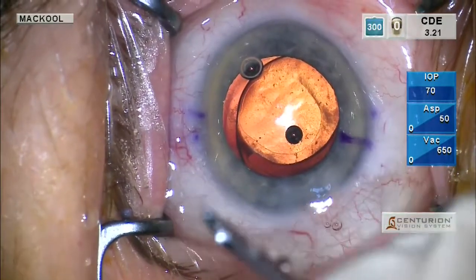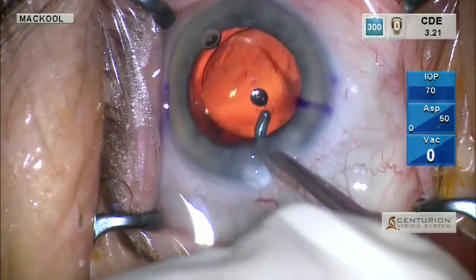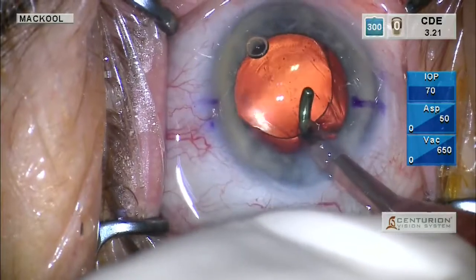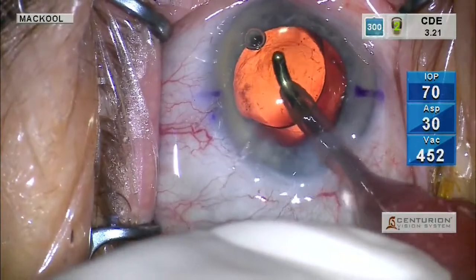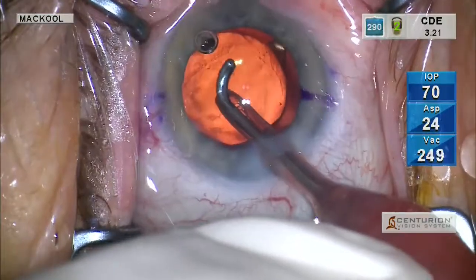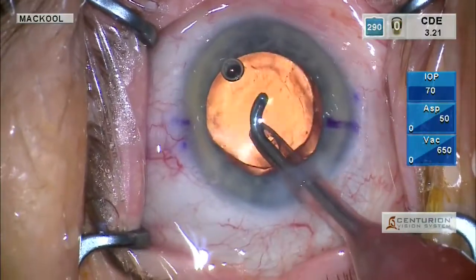And now we're going to remove the OVD, but mostly just from behind the IOL. And because we're leaving OVD, and we know that that means there's a greater chance for a pressure spike, we'll check this patient's pressure in about an hour.